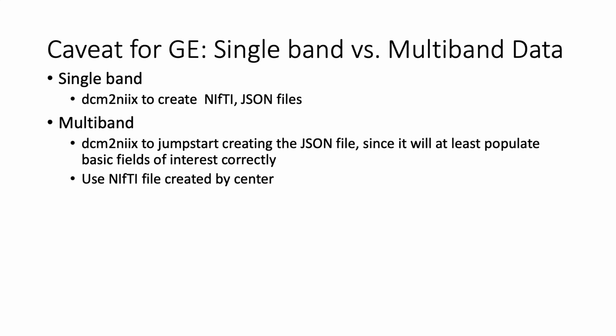One thing that you're going to run into here is on the GE. DICOM to NIfTI plays very well with Siemens. And if you're collecting single band or multiband functional data, it has no problem with doing that conversion and creating the JSON file. It's a little trickier with our GE, because for us to do that conversion right now requires the DICOM and the P file. And so Aaron has put together scripts that are more automated for us and automatically create that NIfTI file for us so that we don't have to do the conversion ourselves.